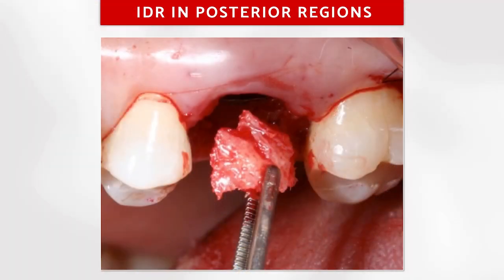I'm going to carry on using corticocancellous graft in the posterior region, the same way that it was performed in anterior regions, upper and down.